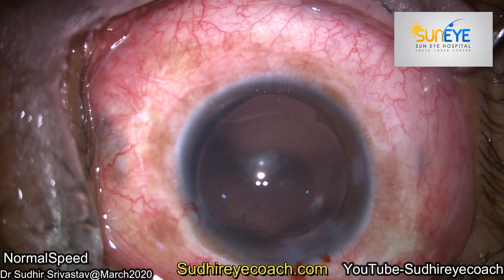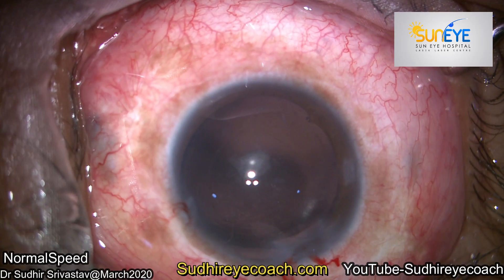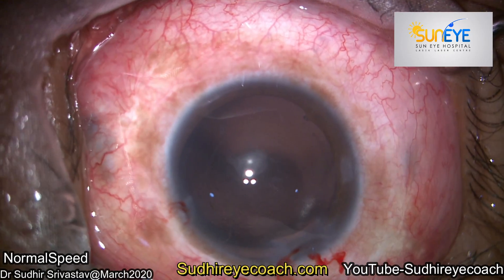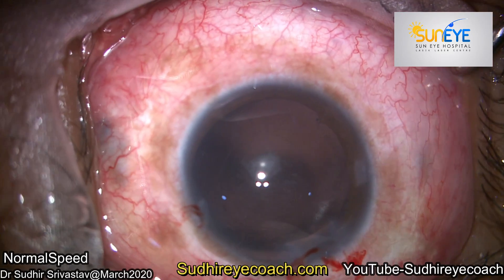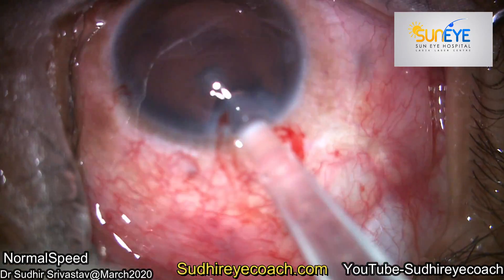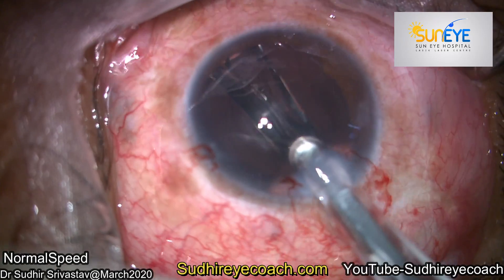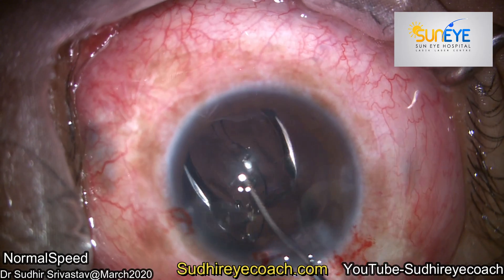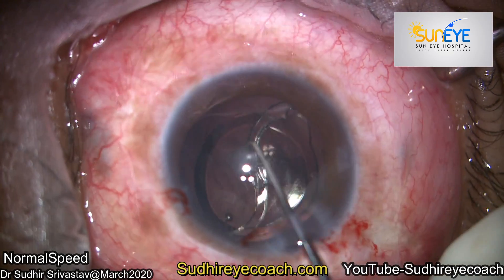During the posterior capsule polishing, I realized that this opacification is not on the posterior capsule — it is present behind the capsule in the vitreous cavity. They were a collection of fine silicon bubbles, which we often get even after silicon oil removal on the vitrectomy side.